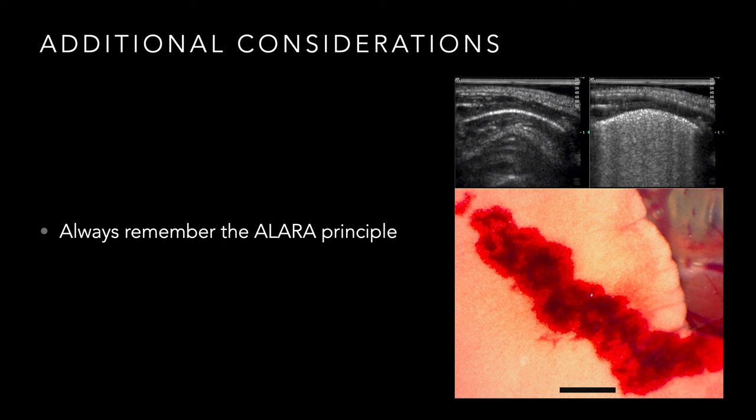And it's listed up at the top of the screen as the MI index. And there's certain FDA approved bio ranges that are safe. And most machines have presets that keep you within those parameters and it's no problem, right?